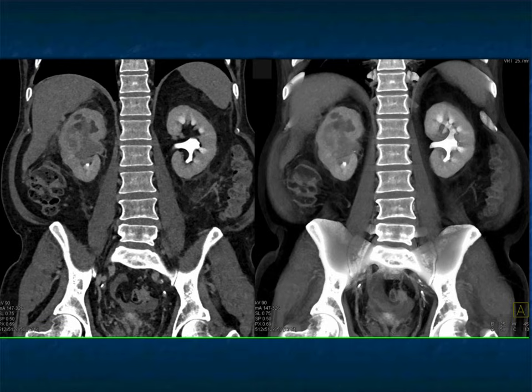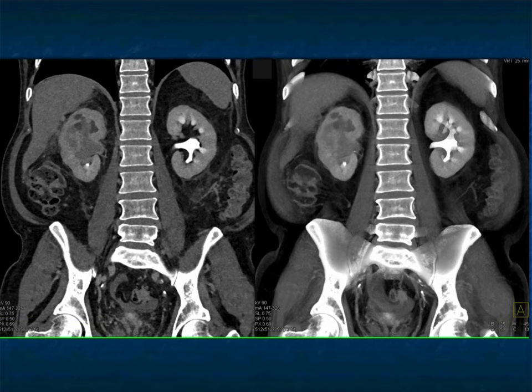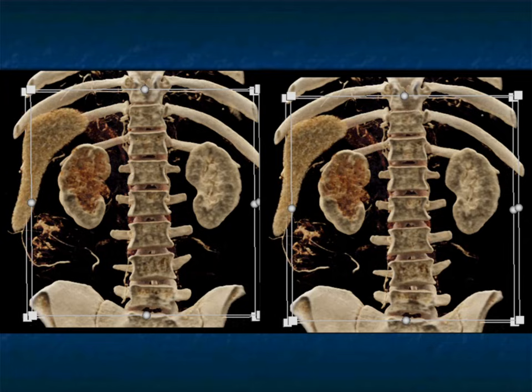Here it is from arterial phase through excretory phase. On the excretory phase, you can see loss of the calyces. When you have a clear cell or papillary, the calyces can be distorted but are typically present. Here they're amputated — that's a very helpful sign of transitional cell carcinoma. And here it is with cinematic rendering.